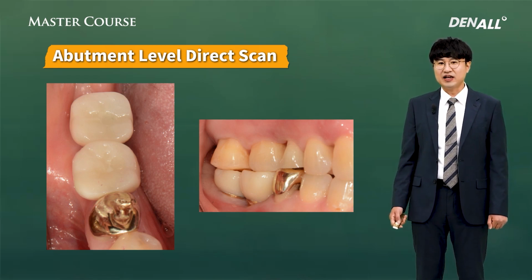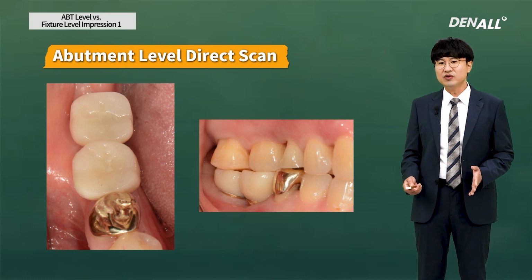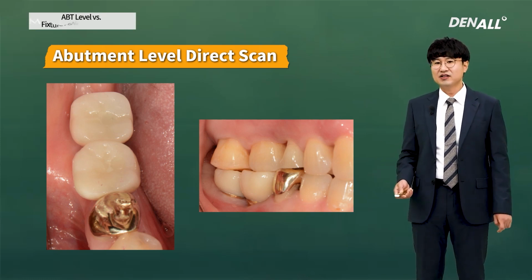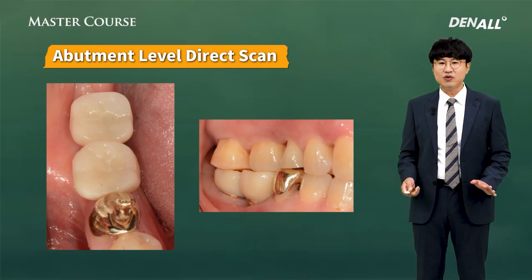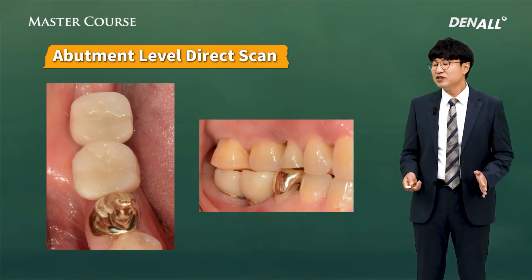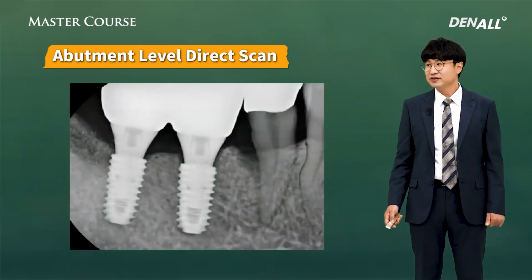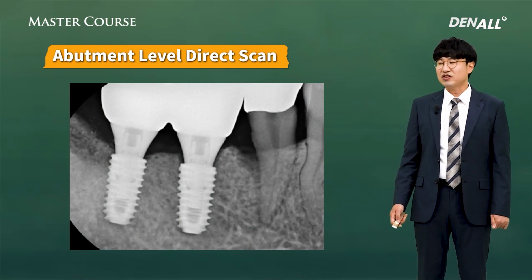But with the custom abutment, as there is no same size abutment, they have to scan it with the model scanner at the lab first before giving it to me. Then, even with a custom abutment, you can scan only up to the area you can see, give it to the lab, and through merging, the subgingival margin images can be easily obtained. I only scanned up to the area that I could see, but through merging, I could easily obtain the margin information.